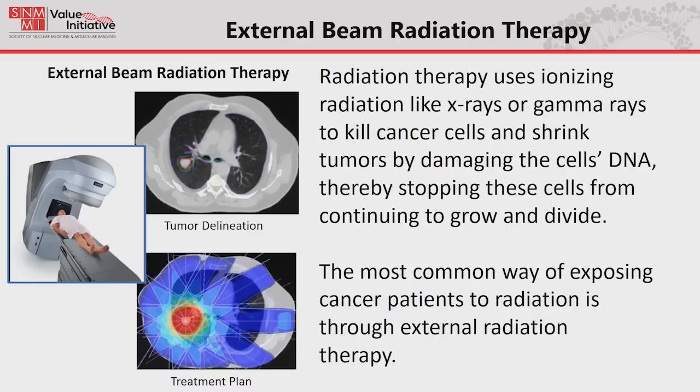Here we have a CT scan of somebody going through their lungs, and you can see circled, there's a tumor there. And what you do in radiation therapy is you shoot a beam of radiation, which is sublethal, from one direction, right? And it goes on through, still a lot of radiation. But then you do it from another angle, and then they overlap. And where they overlap, you now have twice that dose. And you do it from another angle, and so what you do is you get a lot of dose to the tumor, and you get less to the outside. And that's targeting the radiation to the tumor, but not exclusively. You're still irradiating everything else outside of it. Wouldn't it be nice if you could just get the radiation to the tumor and not this other stuff?